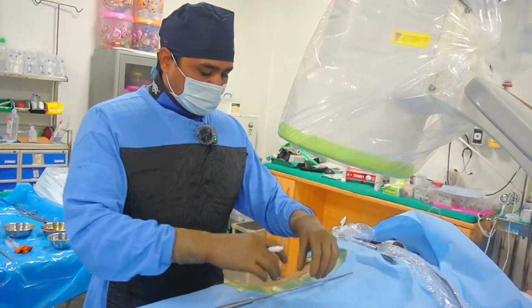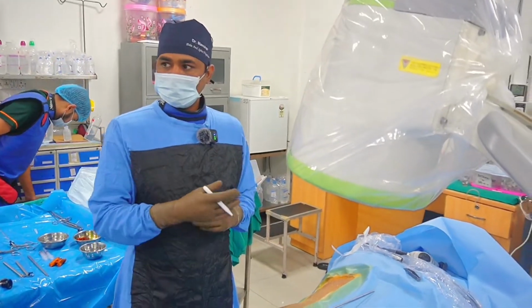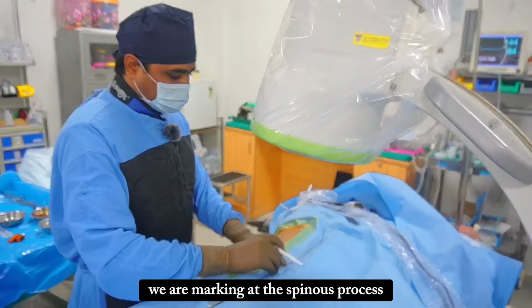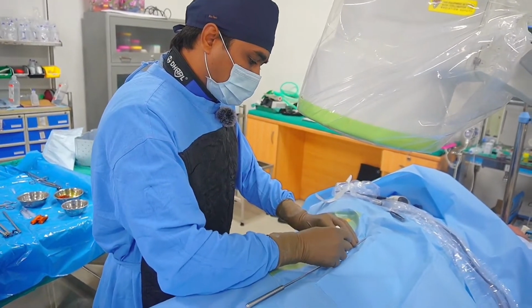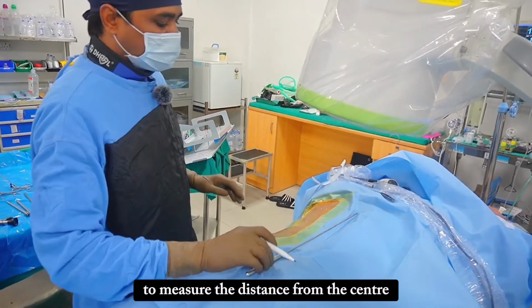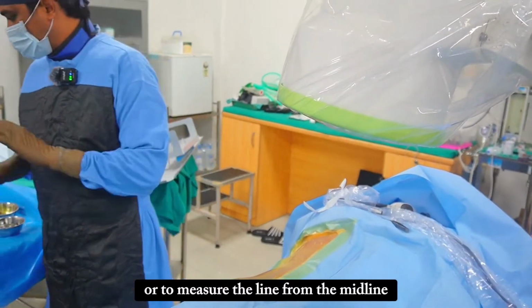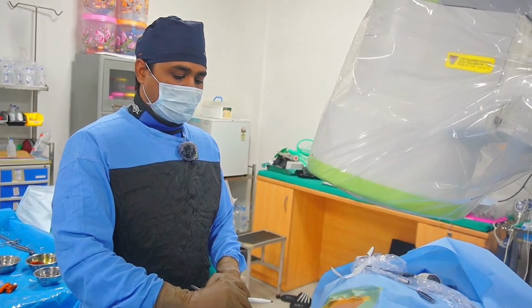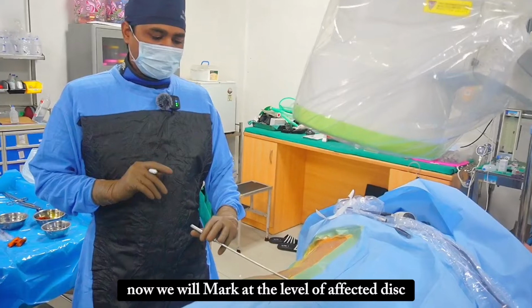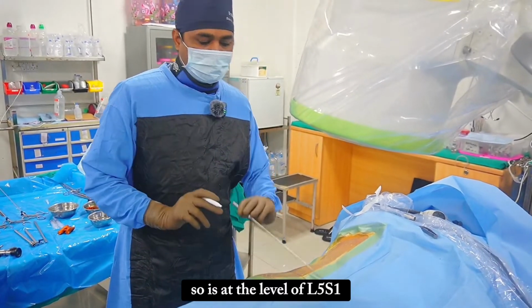Second, we will make a line at the spinous process. We are marking at the spinous process to measure the distance from the center, or to measure the line from the midline. Now we will mark at the level of the affected disc, so it is at the level of L5S1.